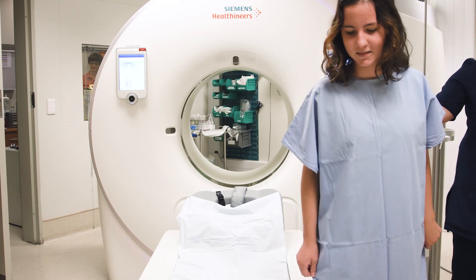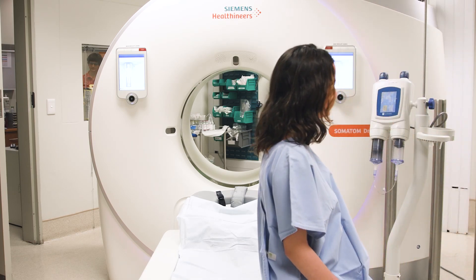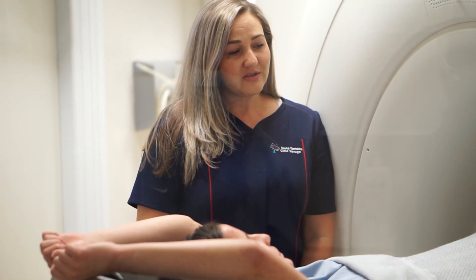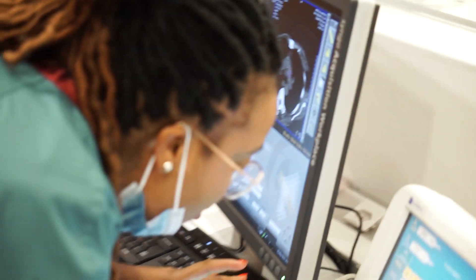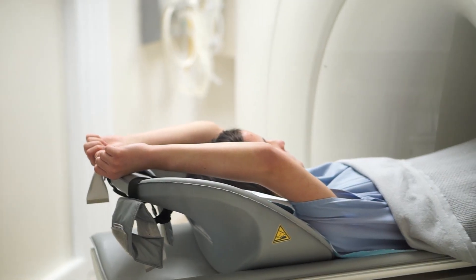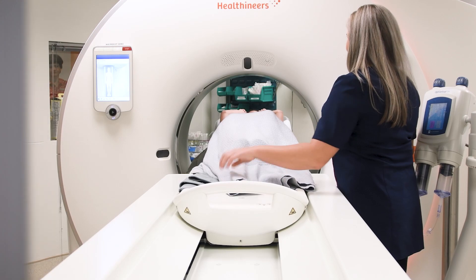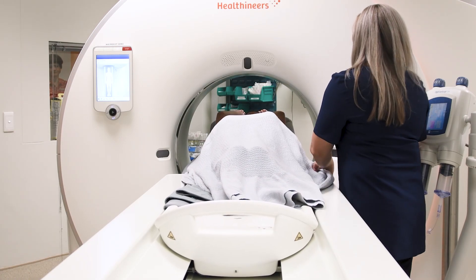We have an X-ray source and an array of detectors that will be absorbing the energy coming from the X-ray. The tube rotates together with the detectors around the body of the patient. You can scan from the head to toe.